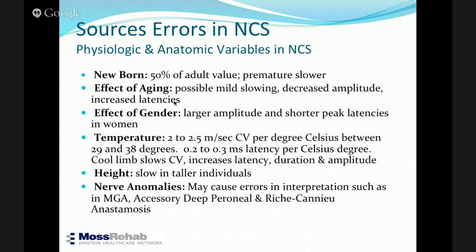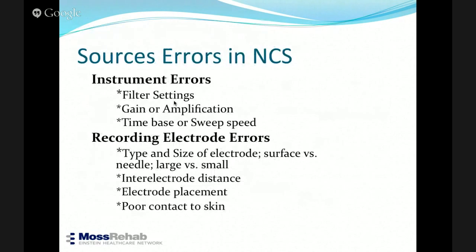So if I see somebody who has a sensory response which is 100 microvolts and is about 3.5 millisecond in duration, I know. Well, did you check the temperature? I'll look at the temperature first, okay? Especially when you're looking at very small changes in the latency, and you're looking for a pathological process and your comparison is different, you have to be very careful.